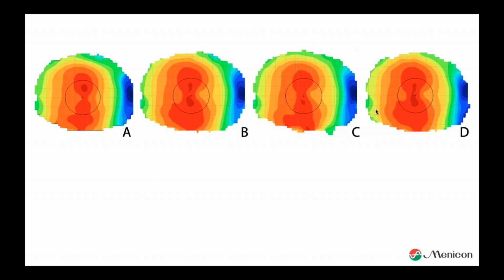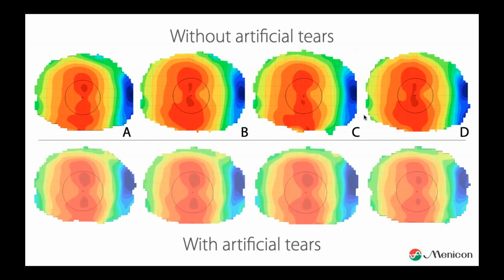So if you have this situation, a quick tip is to use artificial tears. You put them in the eye and wait for a couple of minutes, depending on the drop you're using, but around 5 minutes. If you need a lunch, use gels, and then you can have lunch in between. But otherwise, if you use drops, just wait for 4 or 5 minutes and do the measurement again. And you will see that you end up with more stable measurements. And then you know, okay, we assume that the tear film has the same shape as the cornea, and because every measurement is the same, I can make that assumption. So that is really helping create better topography maps.